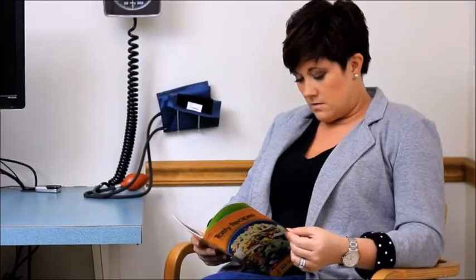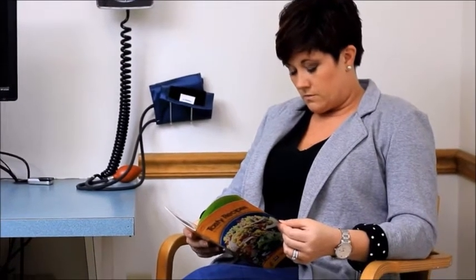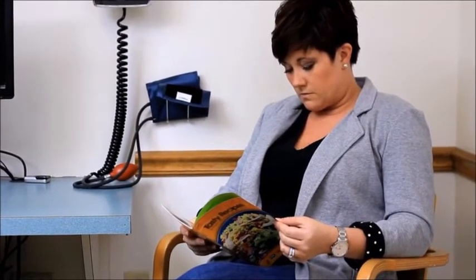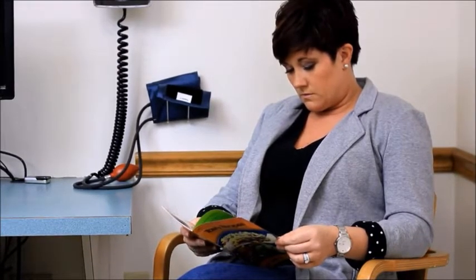Blood pressure readings should be done when the patient is in a resting state. The patient should be seated for five minutes prior to checking a blood pressure so that the reading is not artificially elevated due to the exertion of walking to the room.